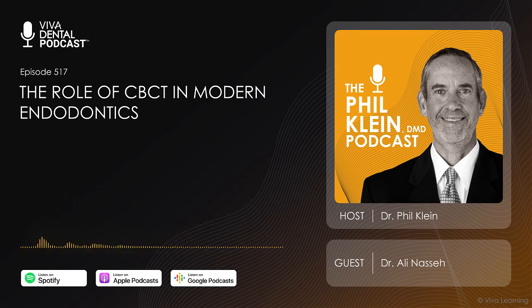Let me ask you about root resorption. Root resorption has been a very difficult thing for some dentists to manage, especially not knowing what the etiology is. And we know that root resorption comes in different forms. We have cervical, we have lateral, we have internal. We know that in an internal root resorption, we need vital cells to perpetuate that whole process. So there's a whole science behind root resorption. Does CBCT help you diagnose root resorption and therefore help you treat the root resorption in the proper way?